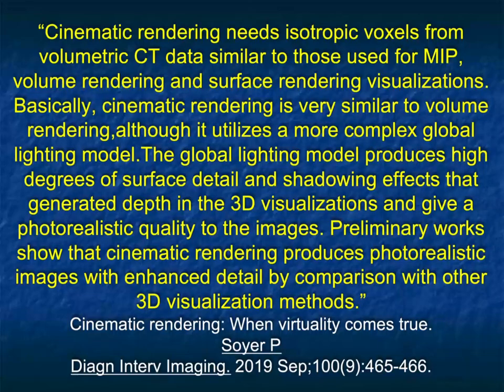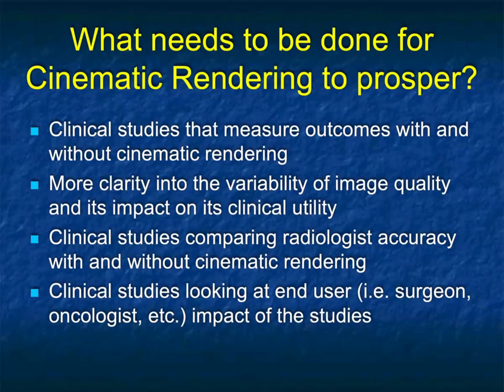Preliminary work shows that cinematic rendering produces photorealistic images with enhanced detail by comparison with other rendering techniques. Now, in my mind, for cinematic rendering to prosper, we need to get away from pretty pictures to data. Clinical studies that measure outcomes with or without CR will be critical. More clarity into the variability of image quality and its impact on clinical utility. Clinical studies comparing radiologist accuracy with or without cinematic rendering or surgical planning with or without cinematic rendering becomes critical.